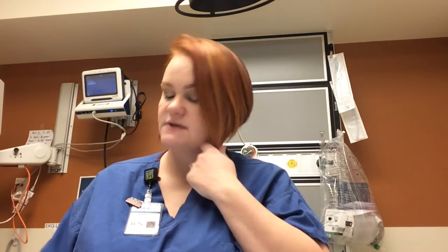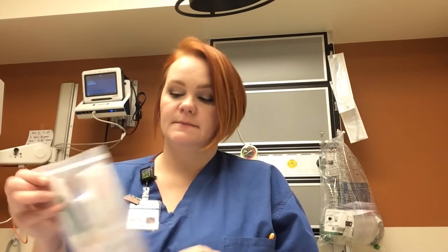For the physician, you're going to want to get them a bedside table so that they can open their chest tube tray, which is considered sterile, up on that table. You'll also want to make sure that they're in full PPE, and in some cases when it's emergent, that sometimes just means a mask and gloves or just gloves. Once the physician is ready to go, he or she may ask you to put some extra 4x4s on. There is a scalpel in the tray, but if they want an additional scalpel or a certain specific one, there are some kits or bags located within the bin that would have that in there.